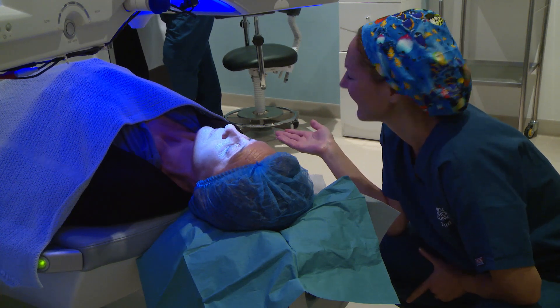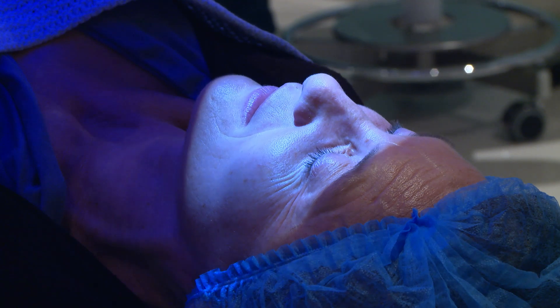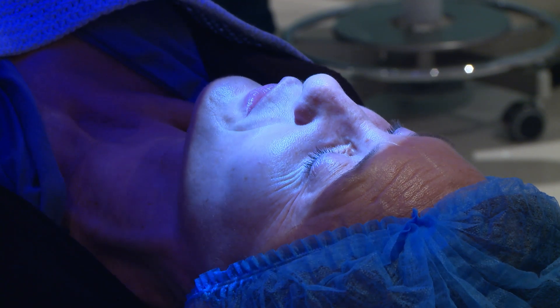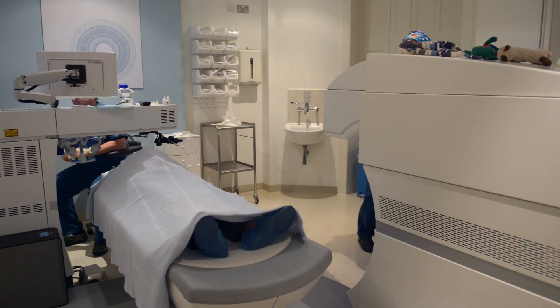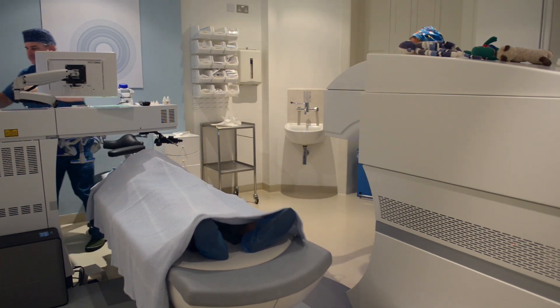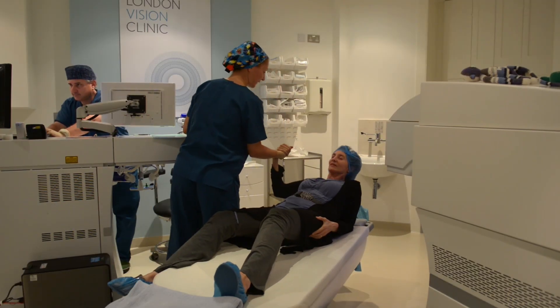Both LASIK and RELAX Smile take approximately 12 minutes, treating both eyes. It's important to remember that the laser is only used for 20 seconds at a time. Most of the treatment is spent positioning, checking, double-checking, and making sure everybody's comfortable as we move along.